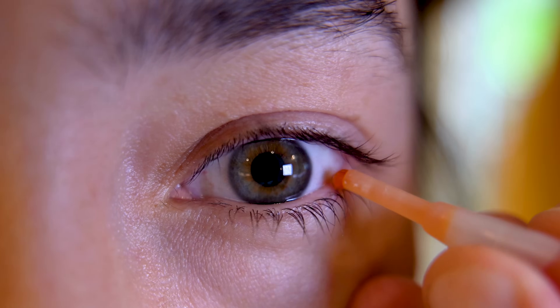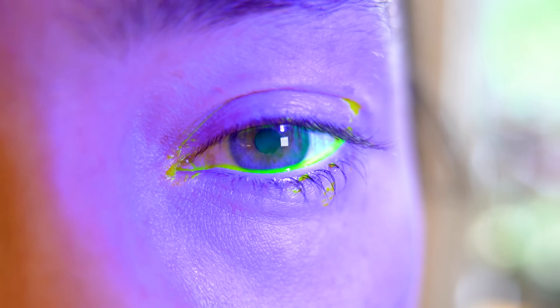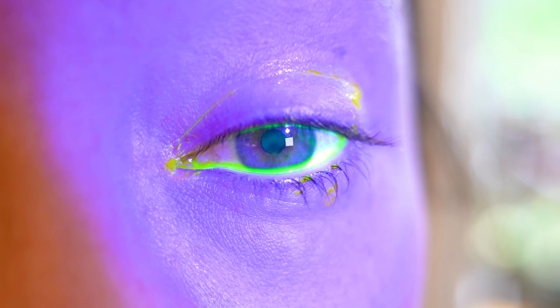We're going to look around the eye systematically: the eyelashes, the eyelids, pulling the eyelid down to look at the conjunctiva, and then looking at the anterior of the eye itself — the cornea and around the pupil. If the patient thinks they've scratched their eye we can confirm this by putting a fluorescein drop or stain into the eye. That will turn the eye a very Halloweeny yellow, but if I shine a purple light on it, it will fluoresce bright green wherever the scratch is. We'll similarly use this if there's a dendritic ulcer effect, which can be an exceptionally painful complication of wearing contact lenses.